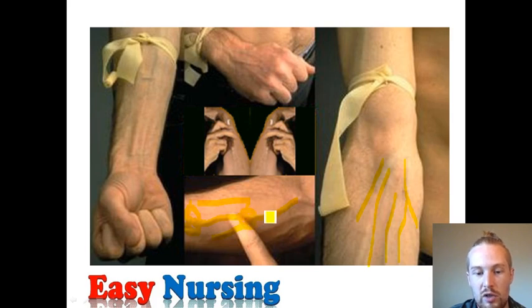If you're going to do it, start right after, because you don't want that IV, the needle, to be pushed up and then be pushing on the valves. Because every time two veins come together, you're going to find a nice lovely valve there. So nice straight veins like this, you could probably start it just about anywhere.